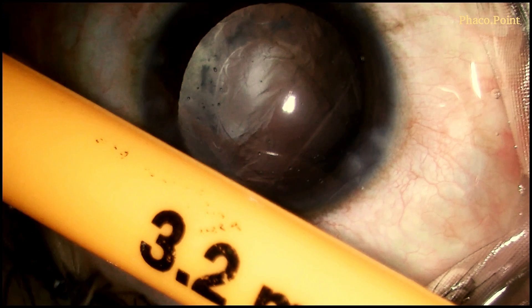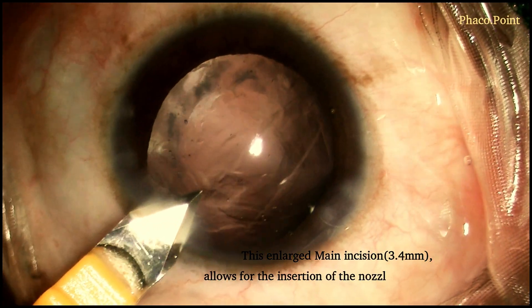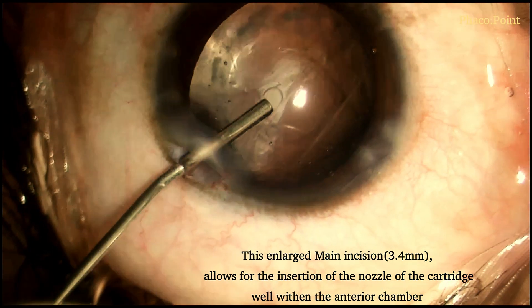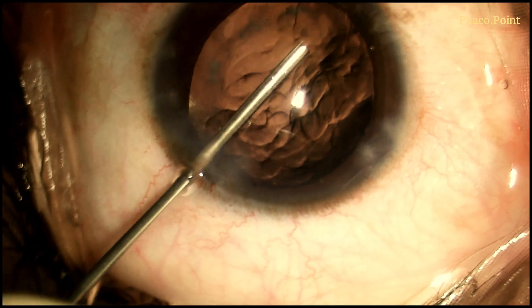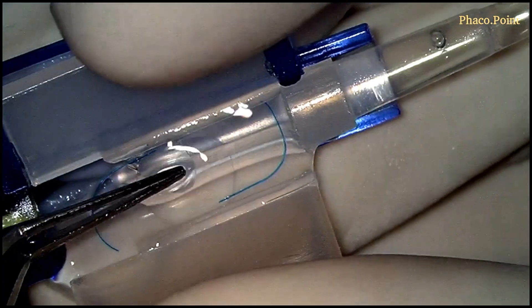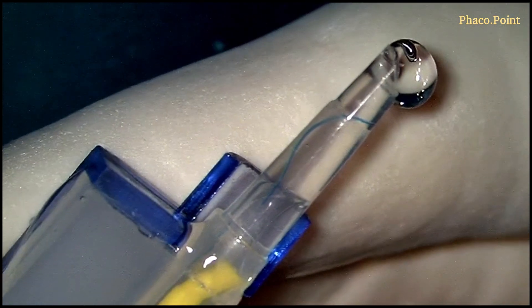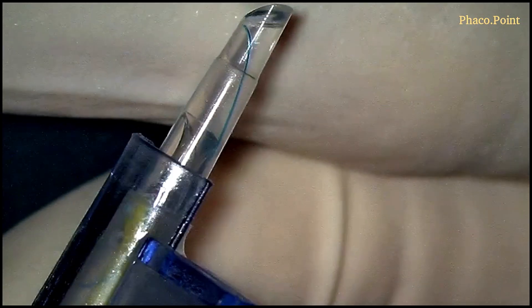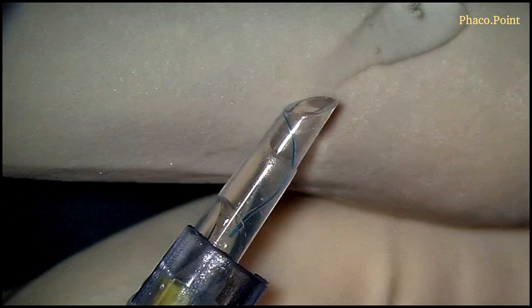The safe implantation of a 3-piece IOL requires the main incision to be enlarged to 3.4 mm. The incision, suitably enlarged, allows for the ease of entry of the nozzle of the cartridge halfway through — a little more if required — into the anterior chamber to allow for the ease of insertion of the leading haptic. The loading of the 3-piece IOL should always take place under direct visualization under the microscope. It is pushed to the front of the nozzle, after which its orientation at the tip always needs to be carefully examined. A mental note should be made of the orientation of the nozzle within the eye to achieve the horizontal orientation of the leading haptic as shown here.